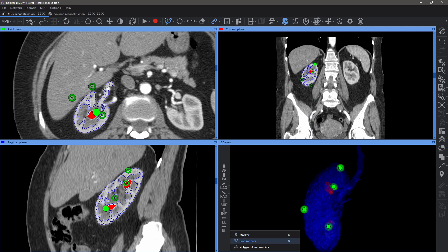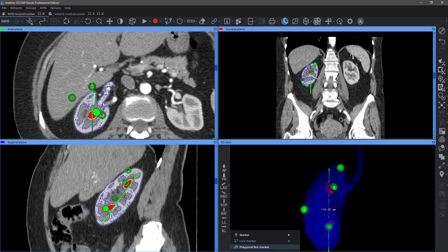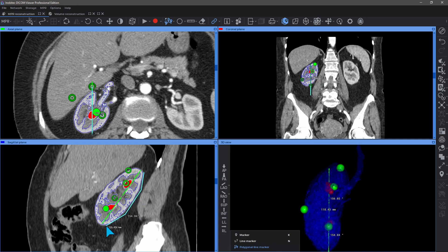It is also possible to display the length of the marker line. Along with the length, the polygonal marker line tool also displays the angle value in degrees for each knee.